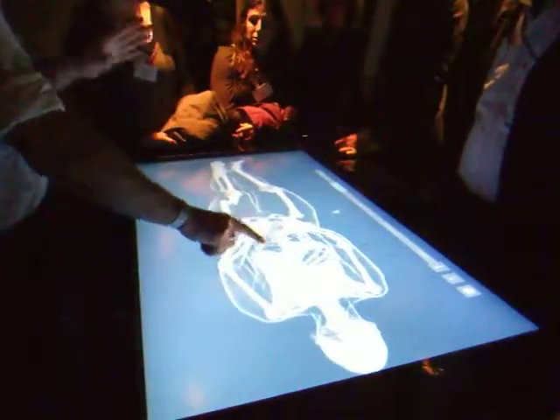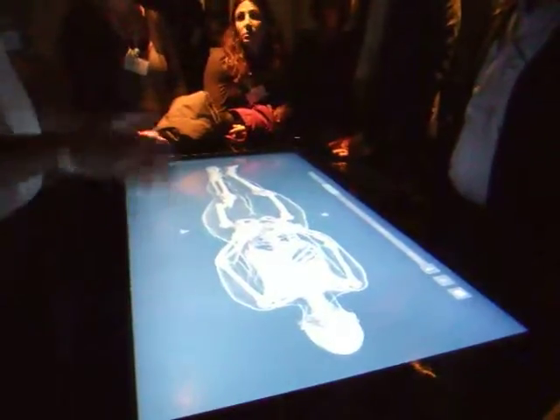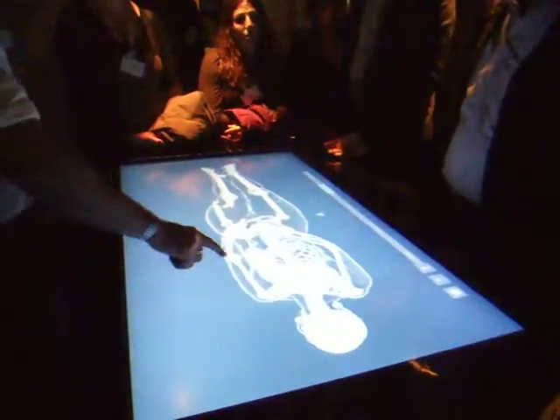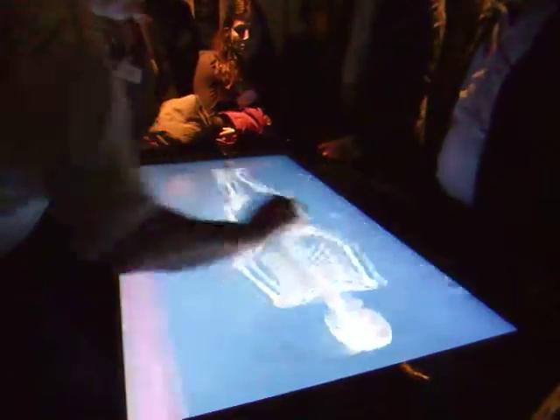So you can actually do, in some cases, better autopsies without doing a physical autopsy. And it can be a very, very useful tool for a doctor. And for the patient.